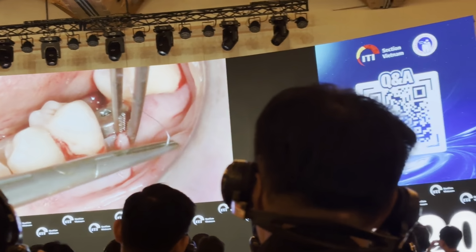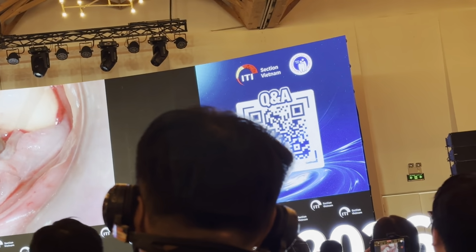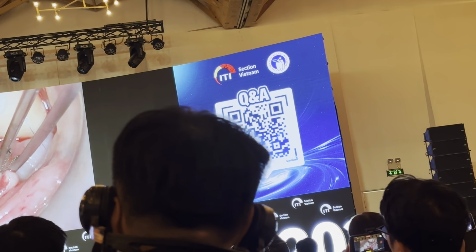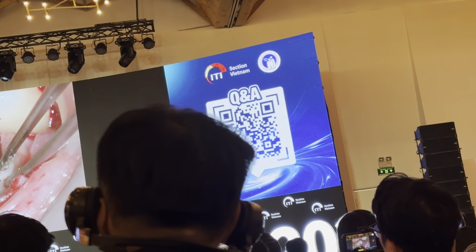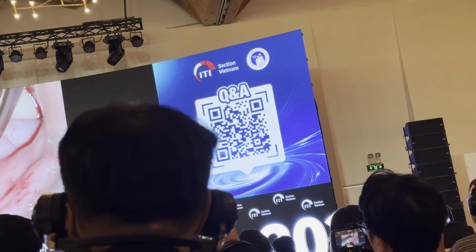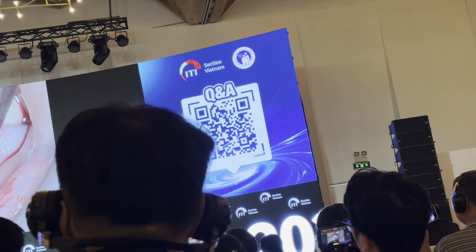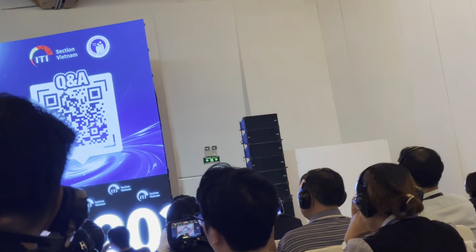This is the position of the connective tissue that is going to be attached, perforating the base of the surgical papilla of the flap, the graft, then we come back horizontally from the graft, and the needle is going to come out from inner aspect toward the external aspect at the base of the surgical papilla of my flap.